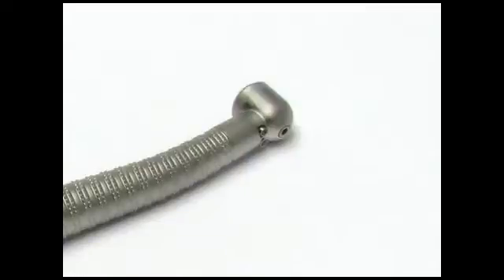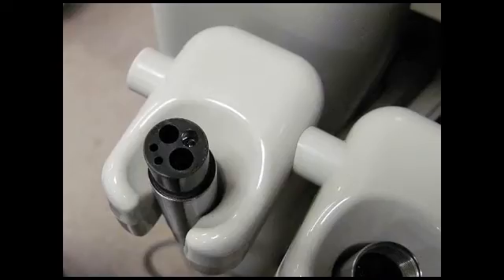Some VetPro 1000 units are equipped with a fiber optic light for the high-speed handpiece. If that is the case, the bulb will already be installed on the hose in the first position on the left side of the unit.